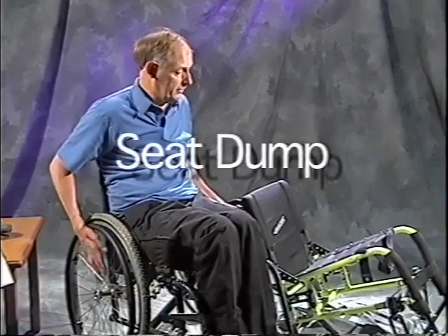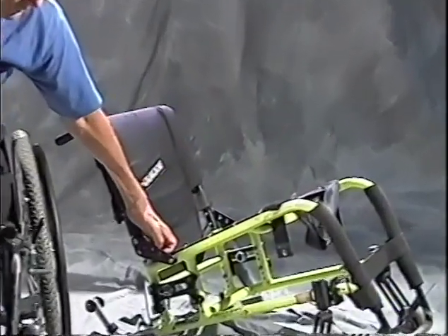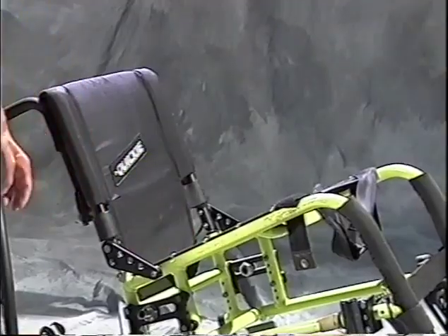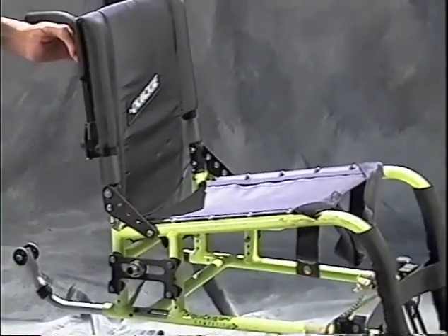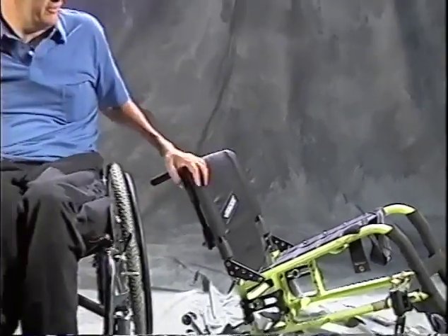The next part that we'll consider is the dump of the chair. And this chair, which you can see if I hold the frame flat to the floor, has a lot of seat dump. And the dump is just the angle of this top rail in comparison to the floor. So the more angle to the back, the more dump the chair is said to have. This chair I use for playing tennis, and it has a lot of dump. And what dump basically does is it sits you in the chair and allows you to keep your body at a 90-degree angle while leaning you backwards a little bit to give you some stability.